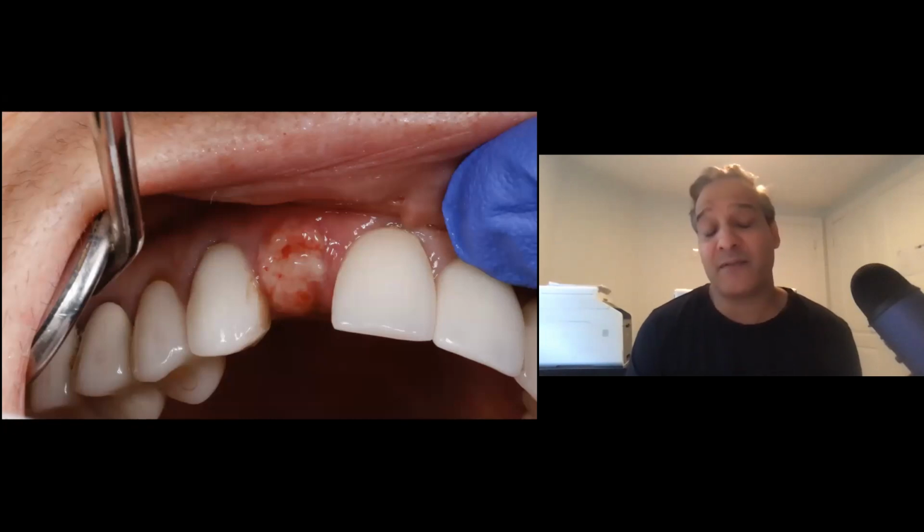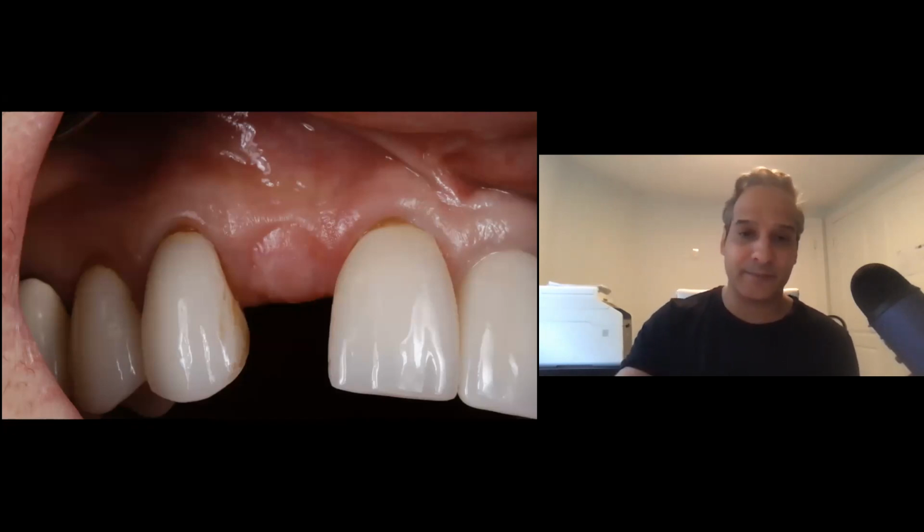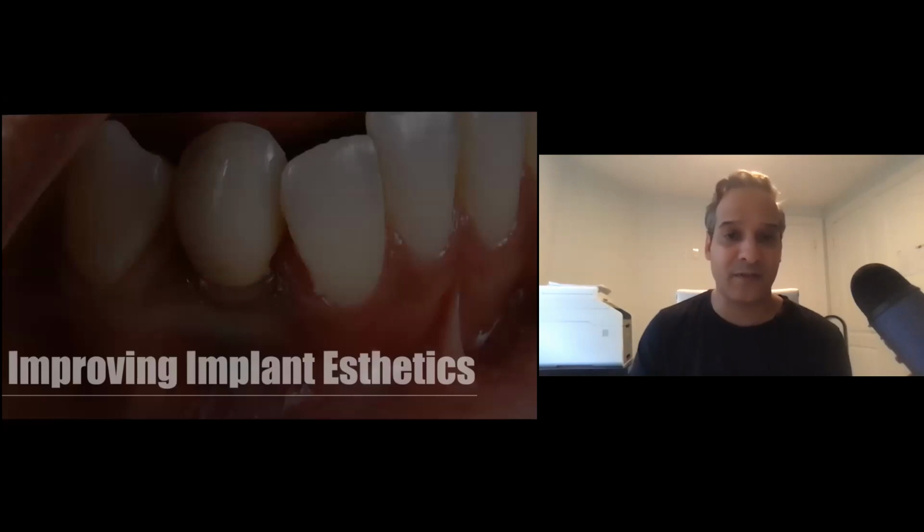And you can see as it's healing at 2 weeks, it kind of swells up with fluid. But it's good because I don't see any necrosis. There's no necrotic tissue. And as it heals, this is the site. So now, again, we've kept our volume. It's maintained the contour. The tissue is nice and healthy. And again, what we find at the occlusal part will then be reused to be tucked into the buccal for additional buccal volume if we need to when we place our implant. So these are some of the other options for sealing sockets.